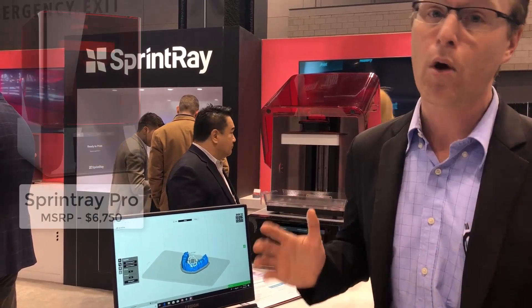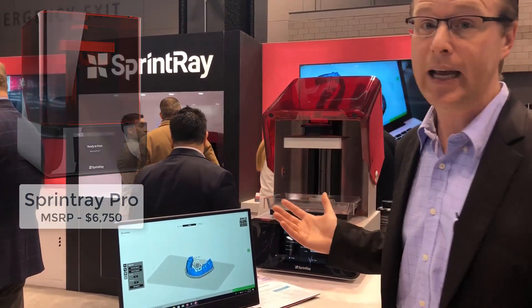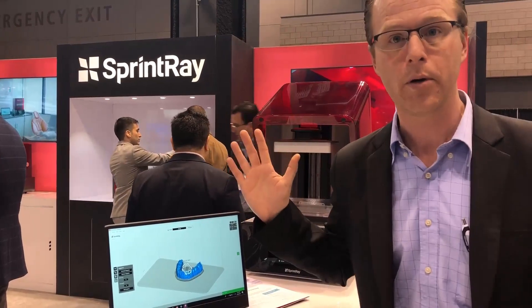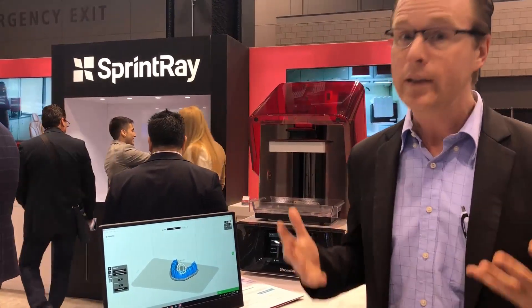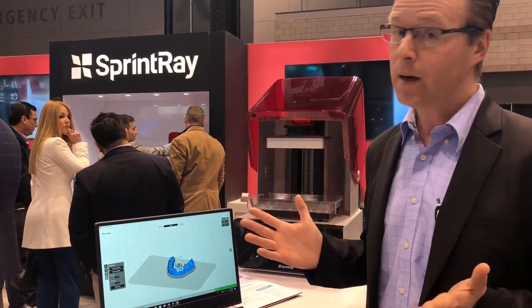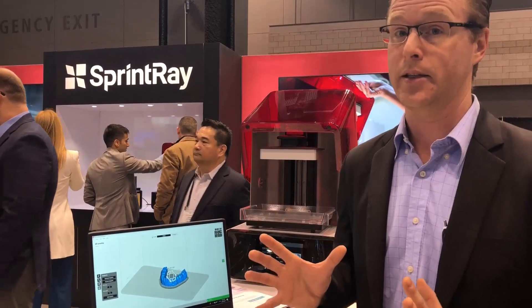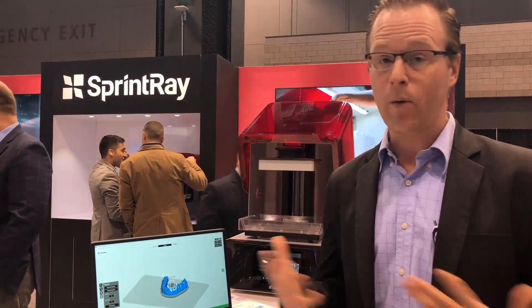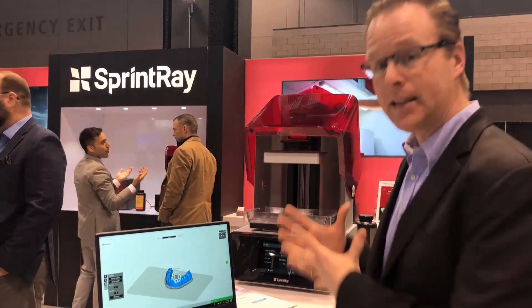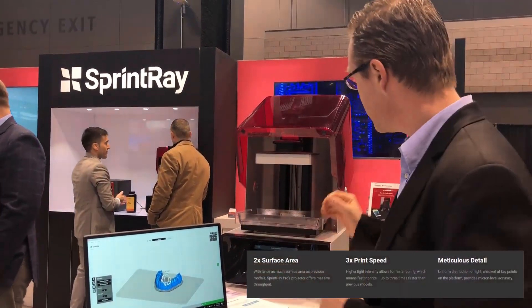The new Sprintray Pro 3D printer just released here from the Sprintray company — kind of like the Moonray 2, per se — but it's really exciting. I've got a quick little demo here from the group at Sprintray. Incredible company, and what they're working on is some really amazing things: taking the Moonray, which is already a great printer, and making the build volume almost two times greater in size.